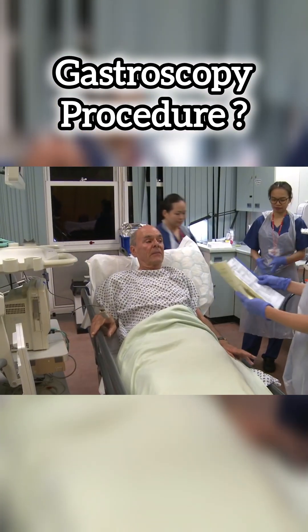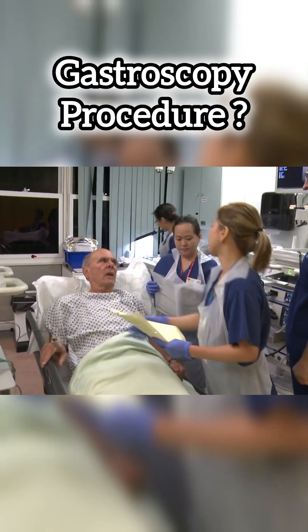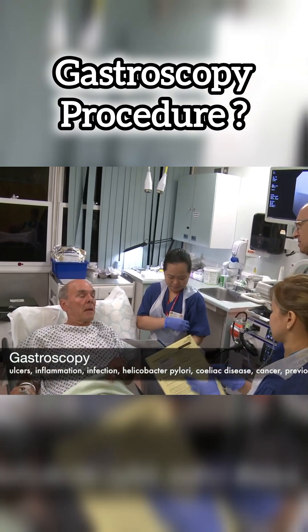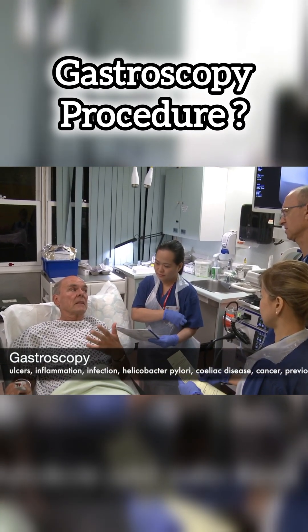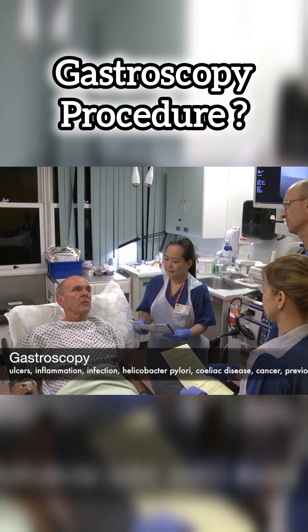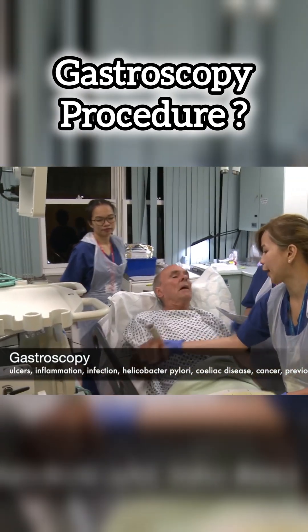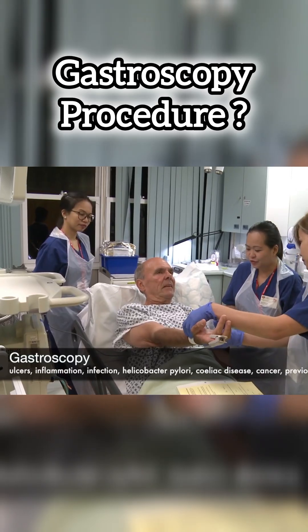We recommend a gastroscopy to find out the cause of your symptoms, to diagnose problems such as ulcers, inflammation, infection, the presence of Helicobacter pylori, the bacteria that can cause ulcers and gastritis, celiac disease which is an inability to digest gluten, cancer, and it can also be used to check a previously diagnosed gastrointestinal condition.